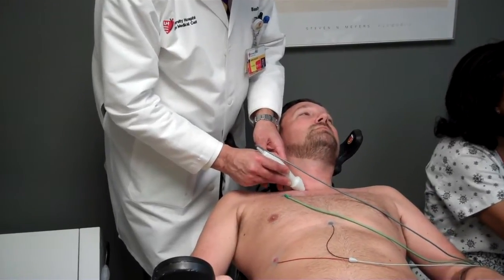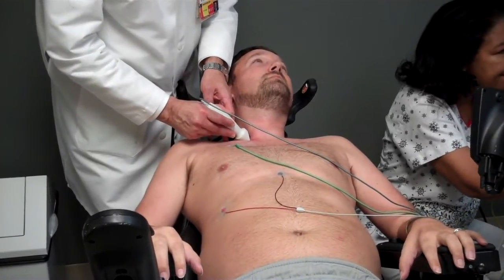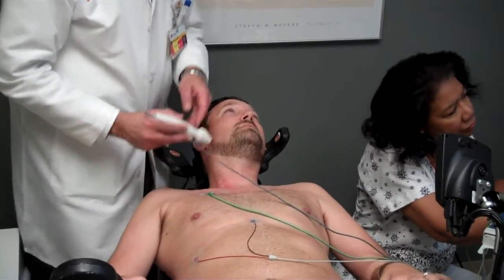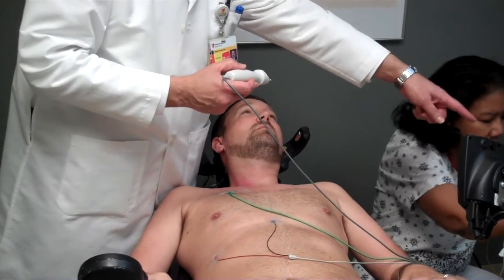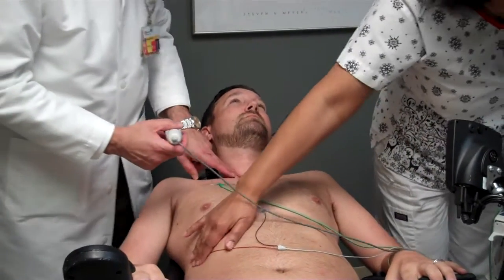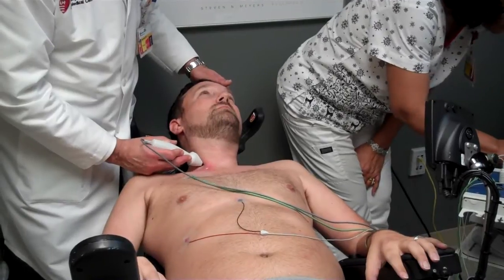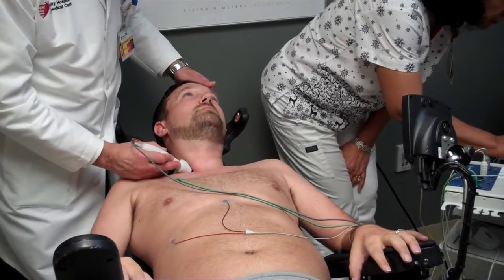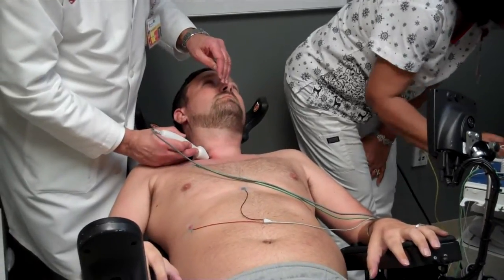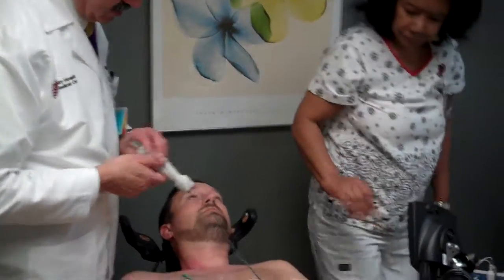I guess it shows. It's going to be easy. Can you give me that gauze again? Okay, look. Let's go to the other side — it's getting red.